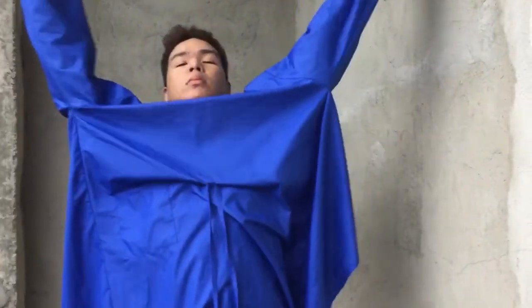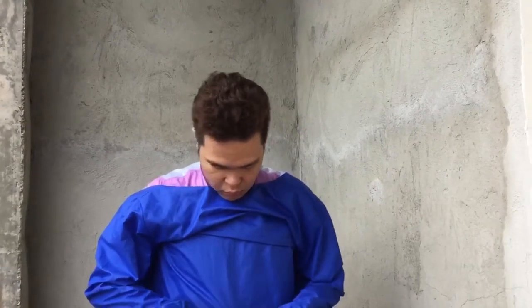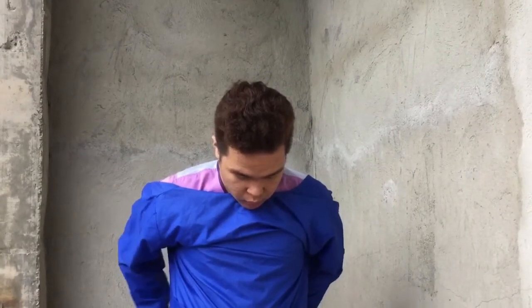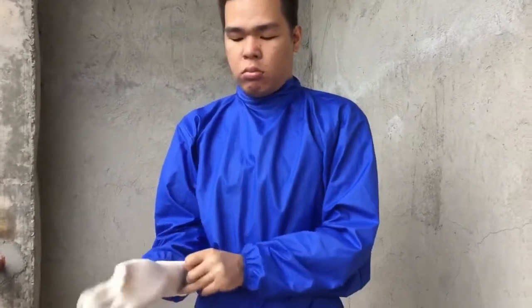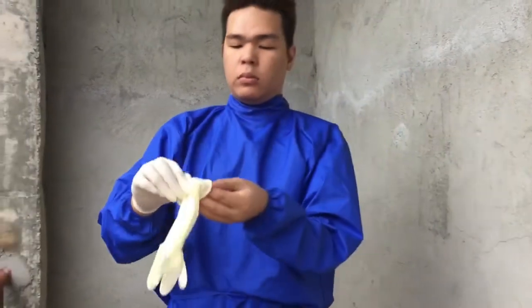Put on gown, gloves, mask, and protective eyewear. Put on the gown by inserting hands and arms into the sleeves, touching only the inside part of the gown. Putting on the gown this way, inserting hands inside, avoids contamination of the gown. Tie the gown securely at the neck and waist. Obtain a waterproof gown if soiling is likely.